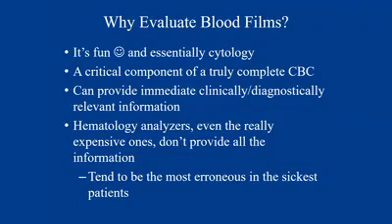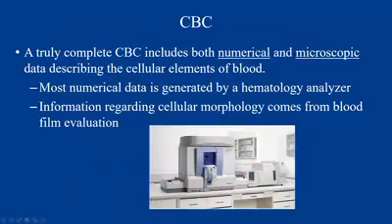And something to remember is that hematology analyzers, even the really big expensive ones, like the ones we have here, that weigh hundreds of pounds, they don't provide all of the information that we need. They just can't. They also tend to be the most erroneous in our sickest patients, which is really unfortunate because that's when we want the analyzer to work the best.